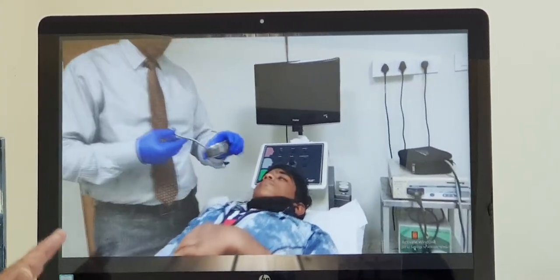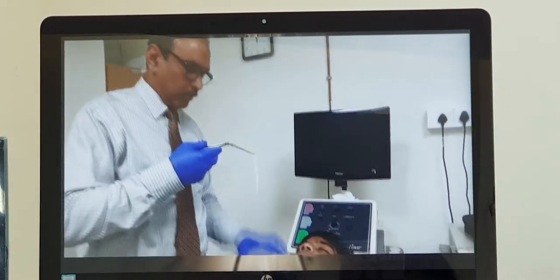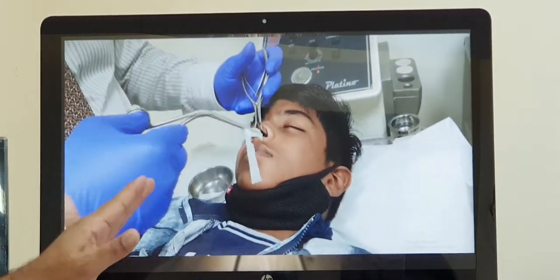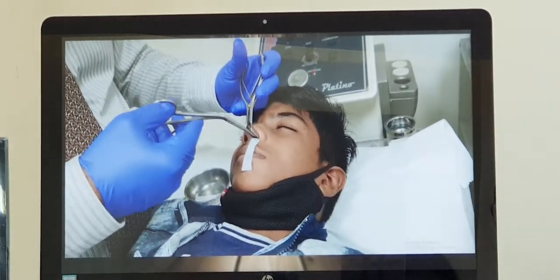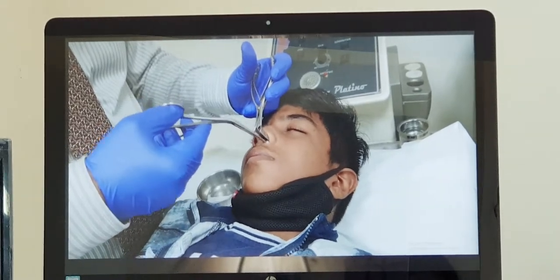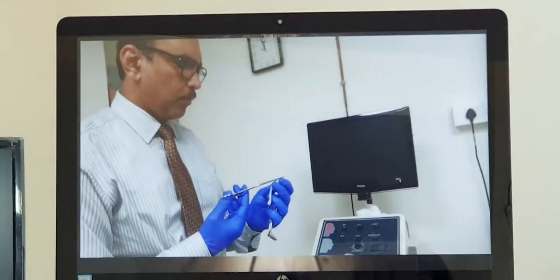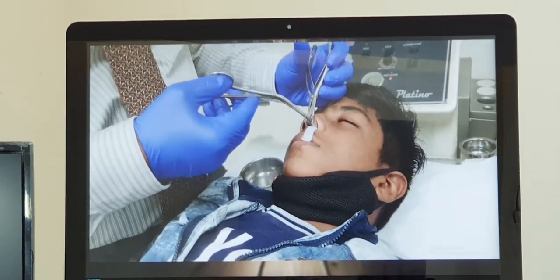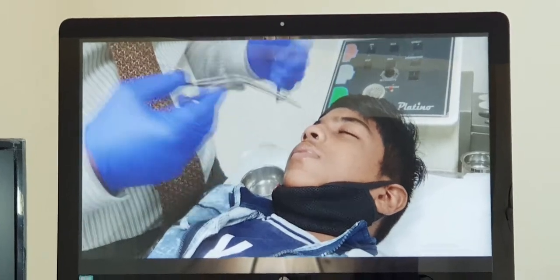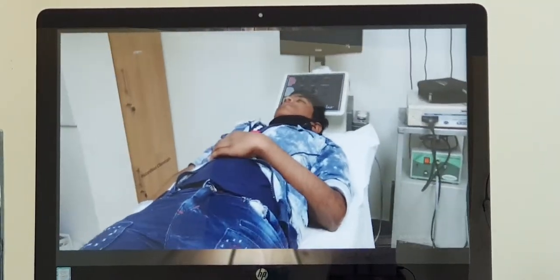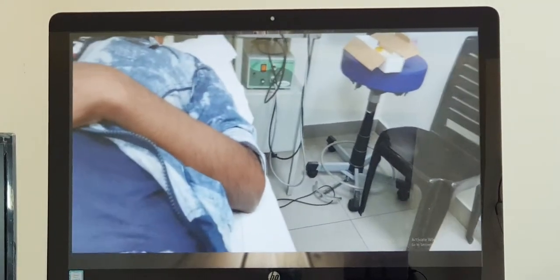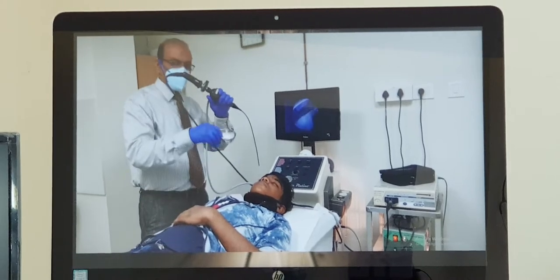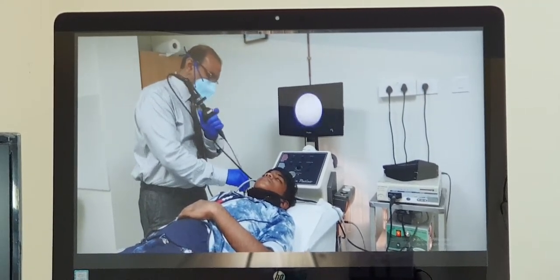Flexible endoscopy can be done in the lying down position or in the sitting position. I am now placing the medicated cotonoids in the nasal cavity. While doing so, I explain to the patient that the whole procedure will be done in 10 minutes and they will not find much discomfort. I instruct them to breathe through the mouth at first, then through the nose as instructed, then to open the mouth and protrude the tongue, say the word 'E' multiple times, cough, and turn the head left and right.